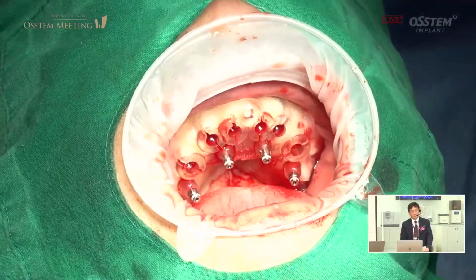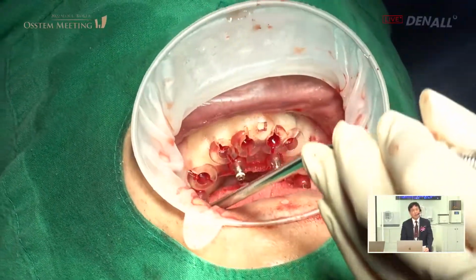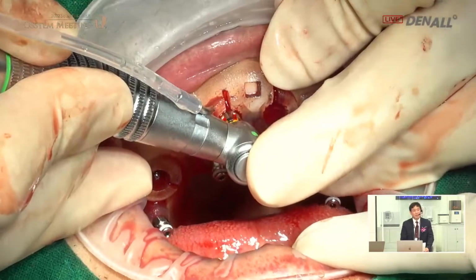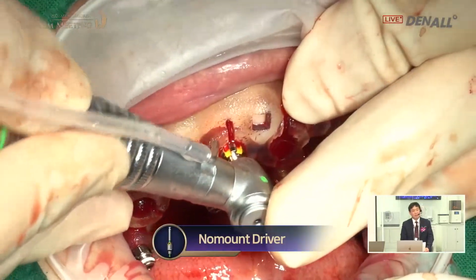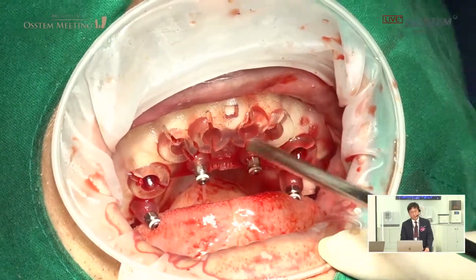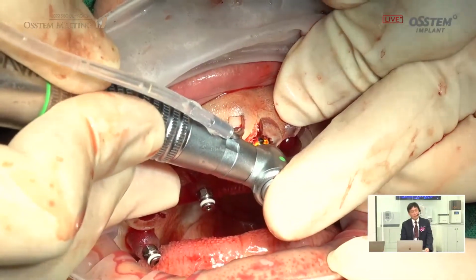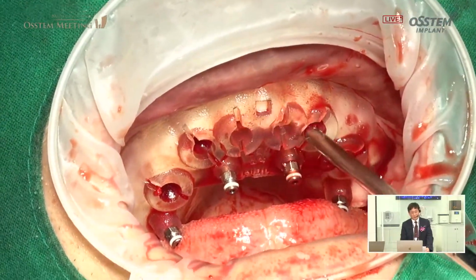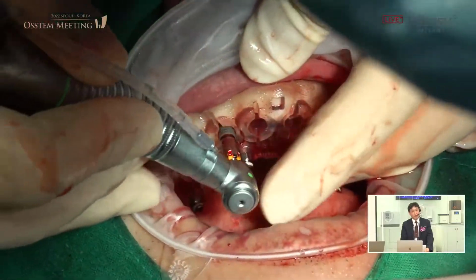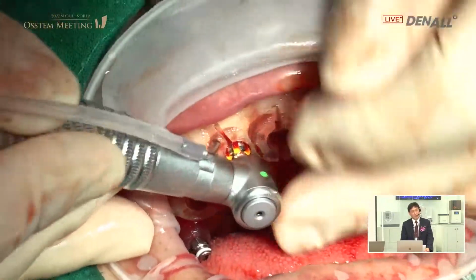I'm going to place the implant. 4.0 by 8.5. Yes, that's right. Final drill is going to be done by 3.5. 4.0 drilling is not going to be done full length. I'm going to stop 2 millimeters before. In 11 and 21s, 4.0 by 8.5 implants are placed. In number 13, 4.5 by 8.5 is going to be placed.